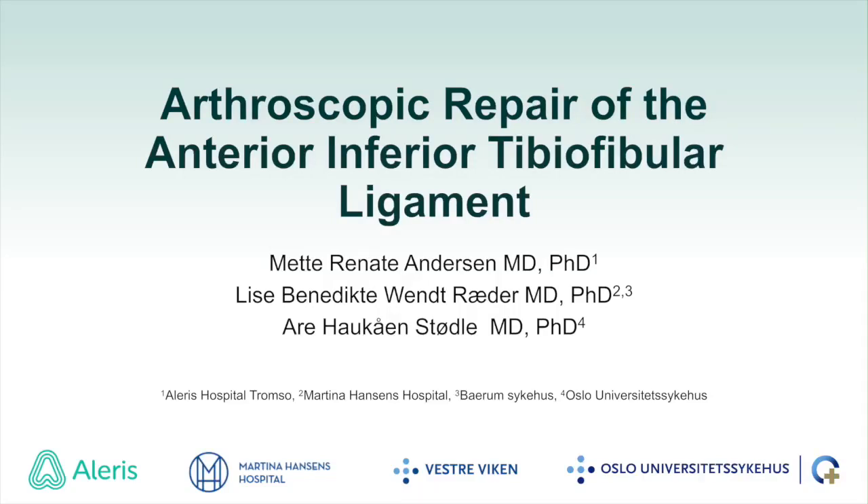The following video presents our technique for a direct repair of the anterior tibiofibular ligament in a patient with a grade 3 syndesmotic injury.